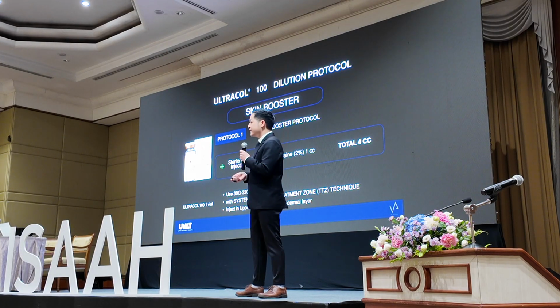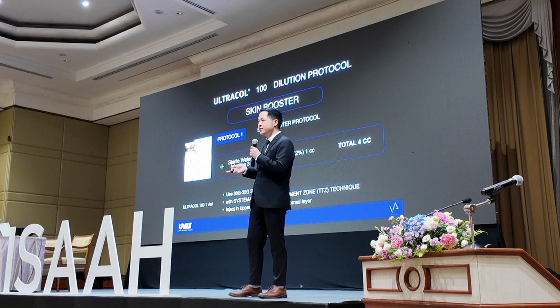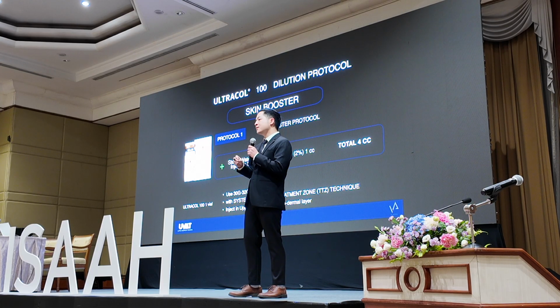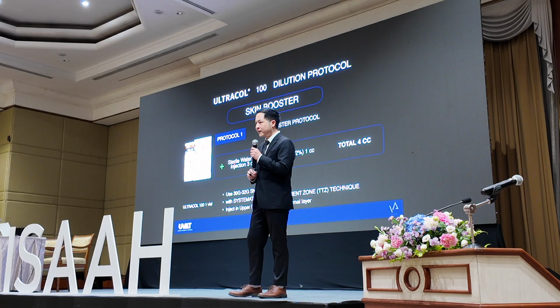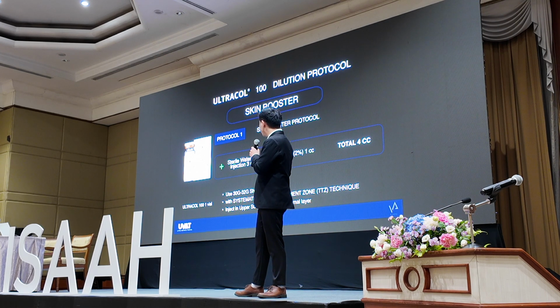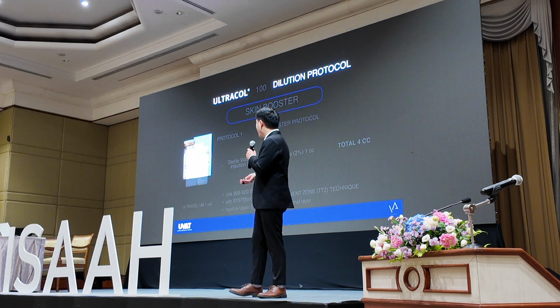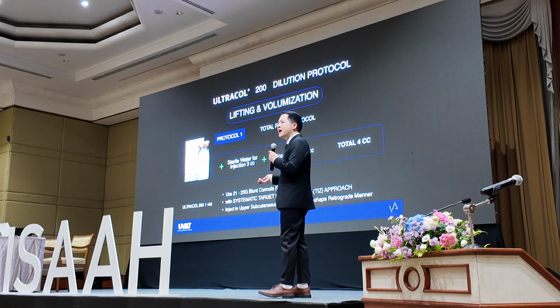So for PDO microsphere, we have a paper showing that this concentration will cause no granuloma formation. So if you would like to use the PDO microsphere, I think you should reconstitute at this concentration. This is for Ultracol 100, and this is for Ultracol 200.